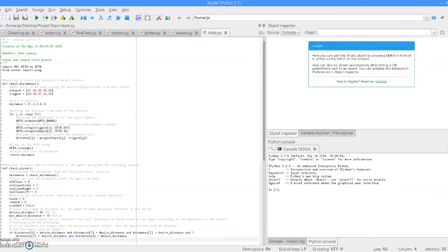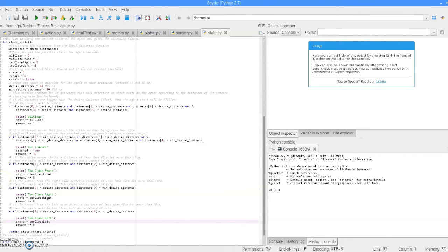In the state file, we can find the functions to check the distances of all 5 sensors, and based on this information, check the current state of the agent. The function to check the distances uses the ping function from the sensor file. This function is then looped through all the sensors, and the distances are saved within a list. To check the state, we first check the distances. With this information, we then implement an if statement to determine, depending on the distances, which state the agent is in, which reward it will take, and if the car crashes or not.